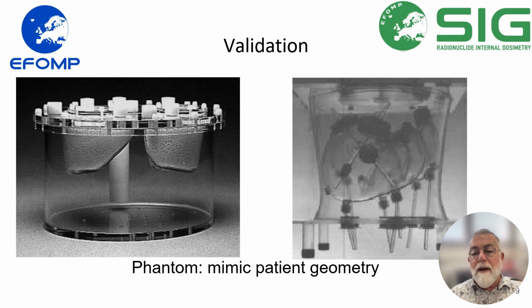And that to the right, the liquid fill, everything is plastic and water, so you will not really test your density correction on that phantom, but it's got volumes that have a realistic shape, like a liver, a spleen, 2 kidneys, even tumors inside the liver, and so on. So you have to select a phantom that is adapted to your procedure or your clinical situation.